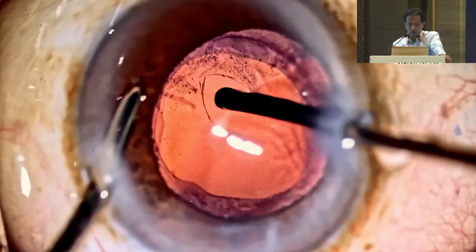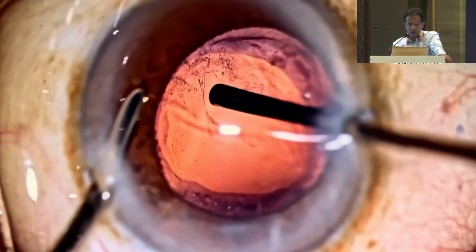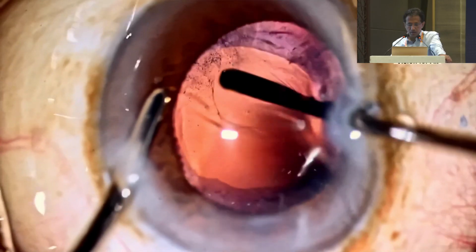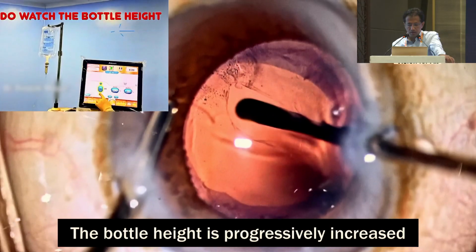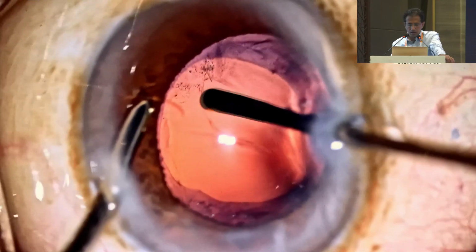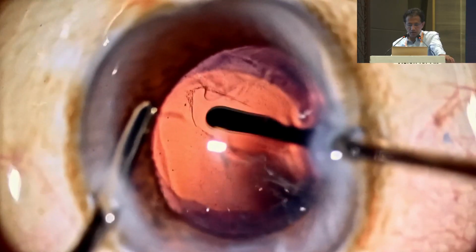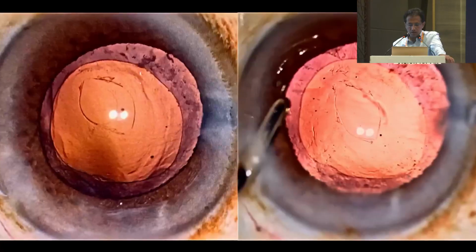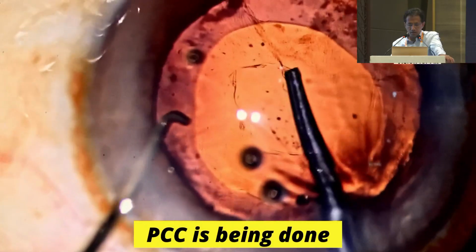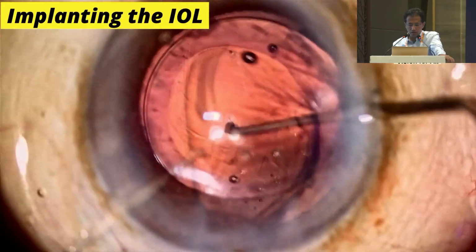At the same time, the vitreous is segmented and the prolapsed vitreous in the antechamber does not have any communication with the vitreous behind the PC. The bottle height is gradually increased as and when we notice the fluttering of the antechamber, suggesting any minor compromise in its stability. The prolapsed vitreous is then taken care of. The PC tear continues to be of the same size. Before implanting the IOL, the tear is converted into a posterior capsular rhexis. The planned single-piece lens could be placed into the bag.